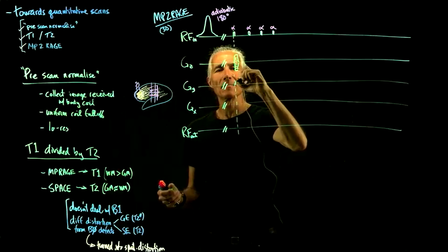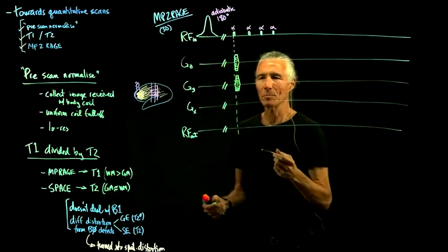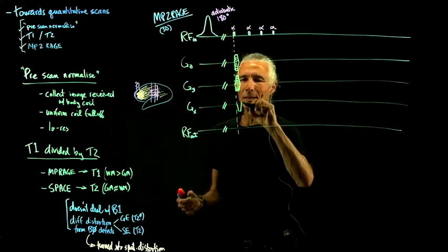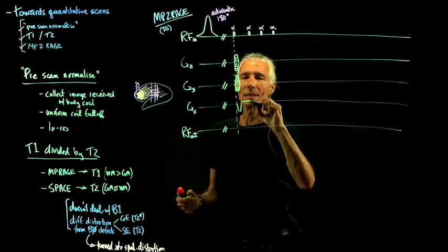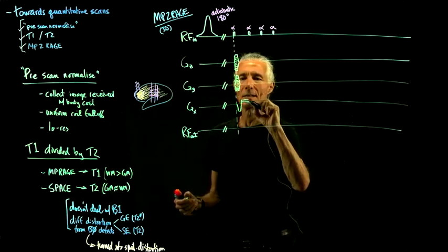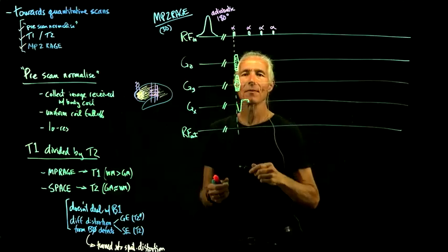And then some phase encoding on the regular phase encode direction, which is not different at all, except it's just a different direction in real space. And then we do a readout, we go to the left side of k-space, and then do a readout like that and collect one line of k-space.